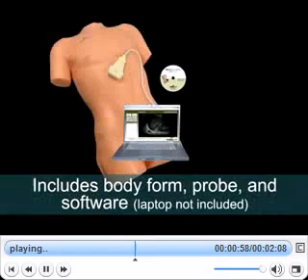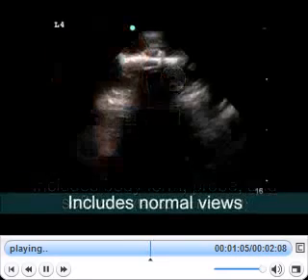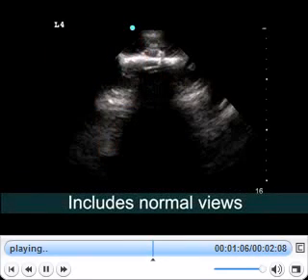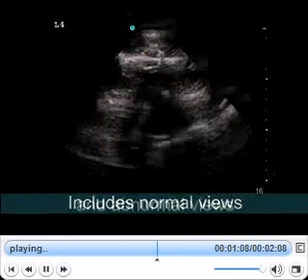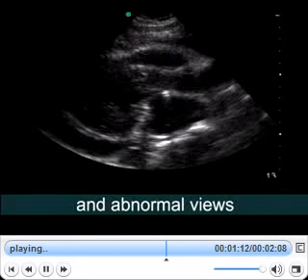Included with the system is a simulated ultrasound probe that plugs into the USB port of a PC and a software disk. Each module includes images of both normal and, more importantly, patients with abnormalities, which can be difficult to access on demand.